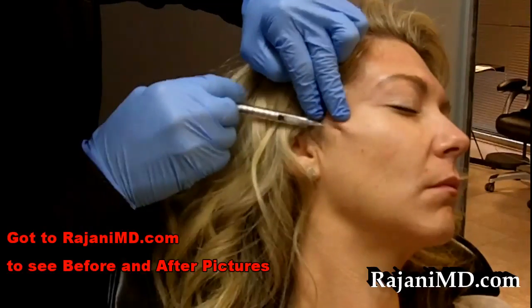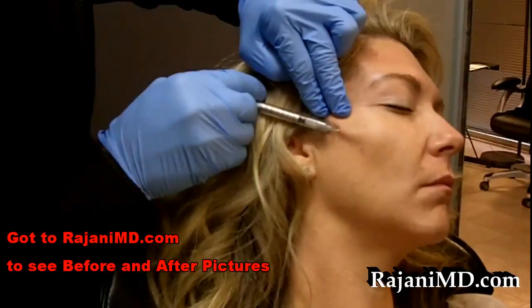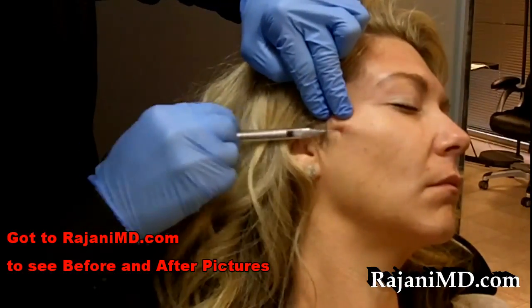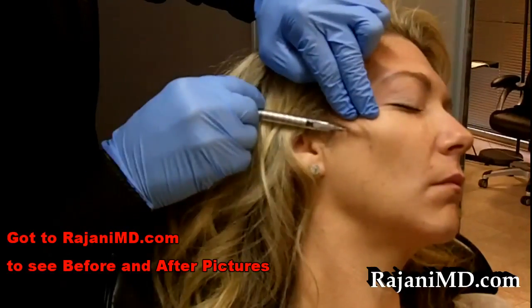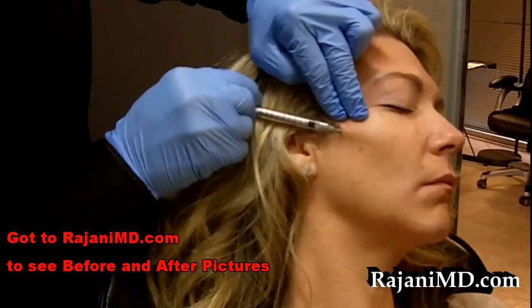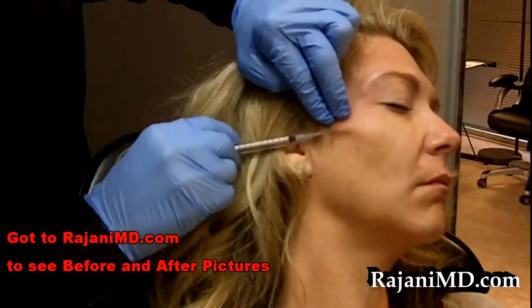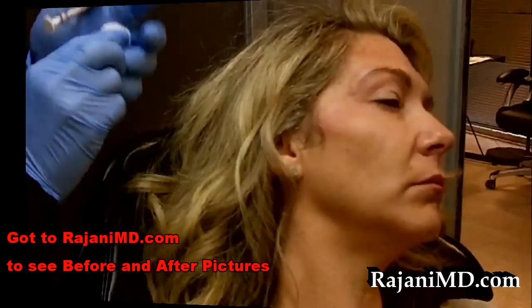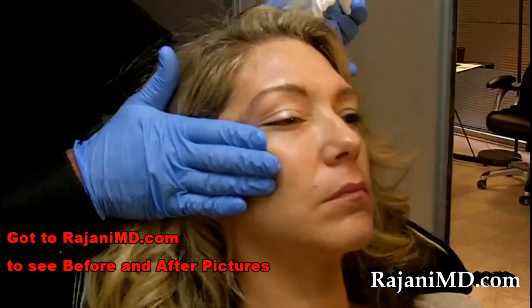Here we're going to almost create an implant that's going to last seven to ten years — it's going to lift the jawline and create a beautiful angle. We don't want too much product underneath the eye because this patient already has a great anterior cheek. It's that high lateral, model-like cheek that we're restoring here. We're massaging — I don't massage much at all with Voluma, but with Bellafill I massage to make sure it's smooth.